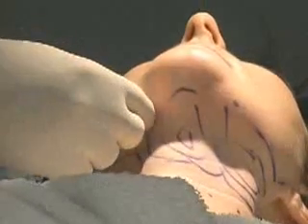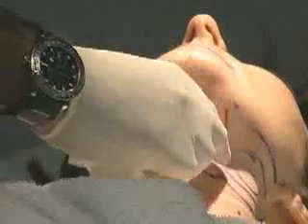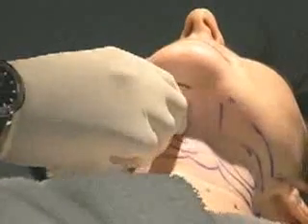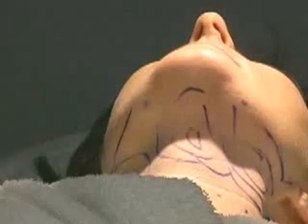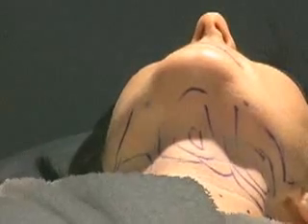For some reason there's not as many nerves inside the fat, and although the needle does hurt going into the skin, once we're finished with the skin infiltration, the rest of the surgery is all done deep to the skin, but on top of the little muscle called the platysma, and that's where the fat resides. So I'm going to wait a couple minutes for this to work, and we'll be back to start.